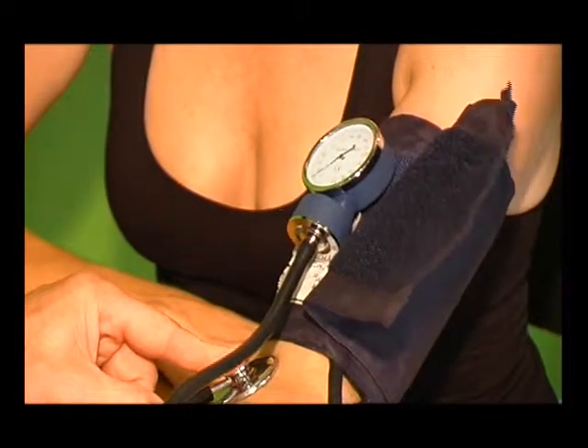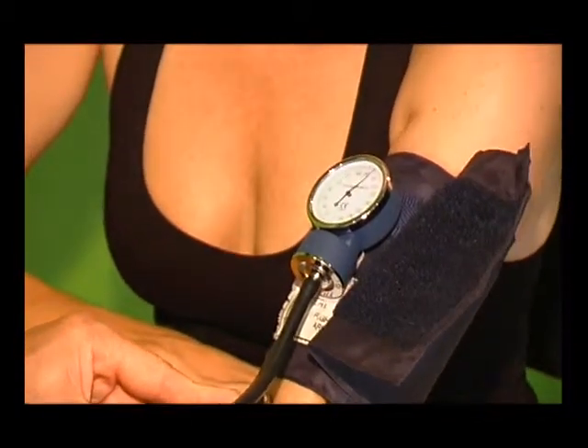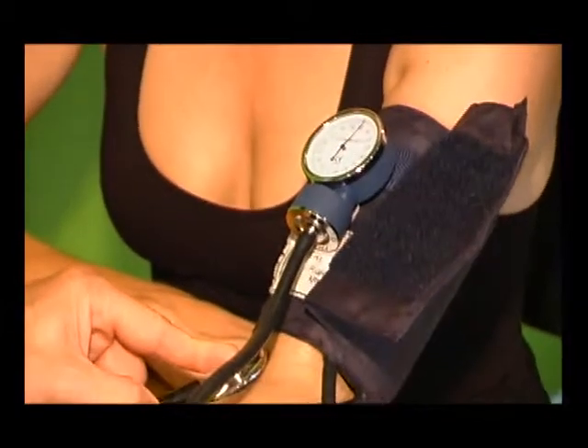You will continue to hear the sounds whilst the cuff is deflating. The diastolic pressure is determined when the sounds either cease to be heard or become muffled. Record both the first reading and this reading.